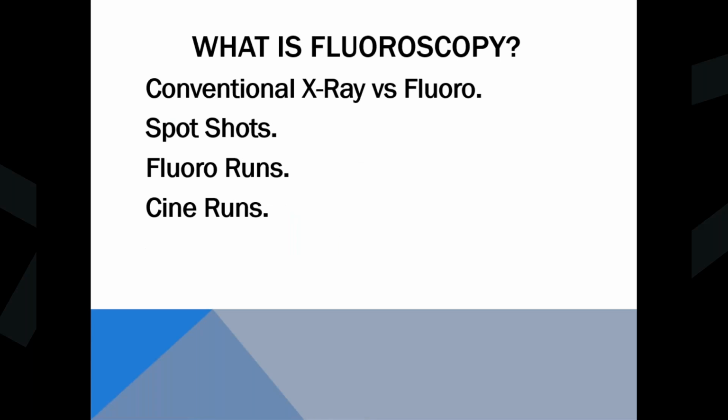So what exactly is fluoroscopy? When I teach some of my other classes, basically what I try and describe fluoroscopy versus conventional X-ray is like your phone. On your camera, you have your photo option, and then you have your video option. Well, conventional X-ray would be like your photo option, and then fluoroscopy would be your video.